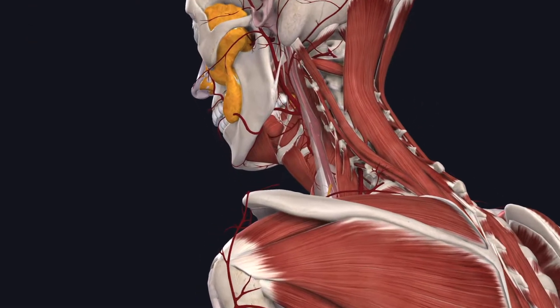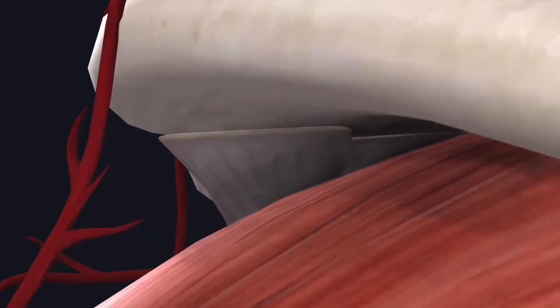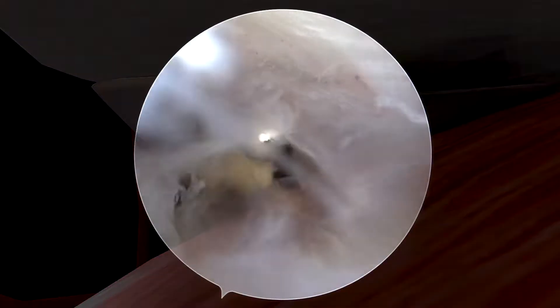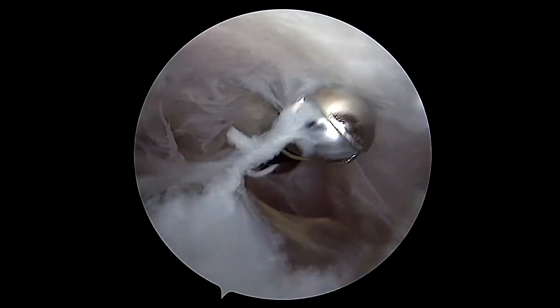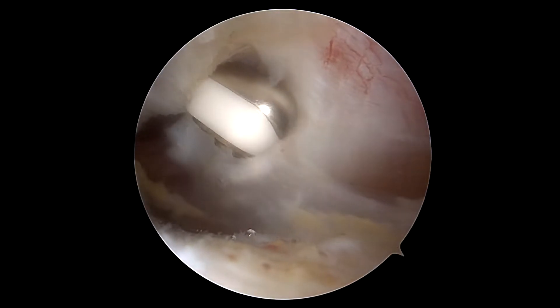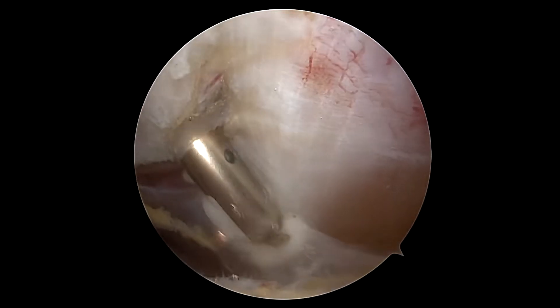To begin the procedure, we start in the subacromial space above the rotator cuff. Here we're cleaning out a number of adhesions and some bursal tissue just to obtain a clear view and proceed with our dissection.